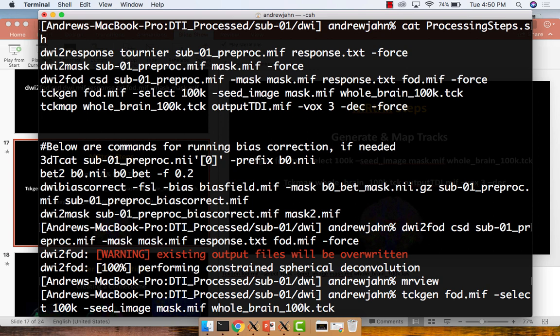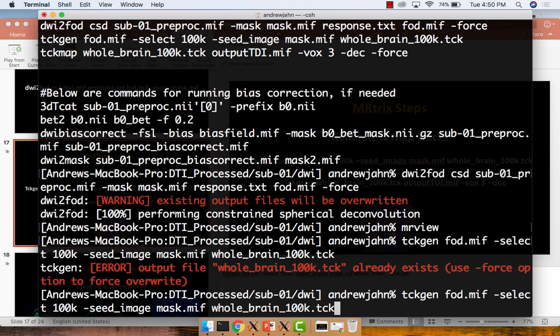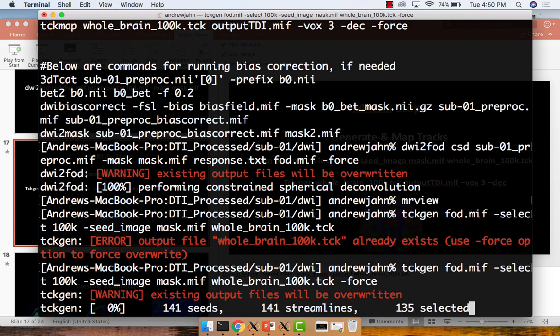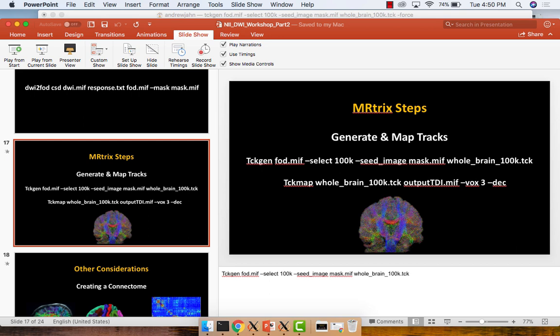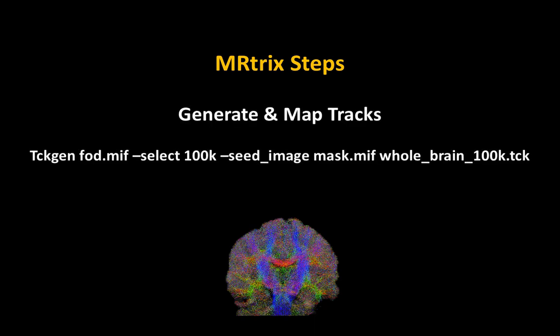I'm going to give you a brief explanation for why this is going to be useful. So we had our fiber orientation density. And as part of that, as we did with the diffusion tensor images, which had measures of things like fractional anisotropy, mean diffusivity, different measures of diffusion, you can do whole brain analyses across subjects to test for where there are significant differences, right?